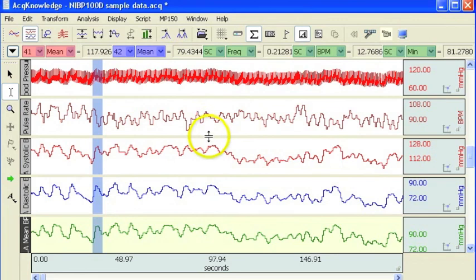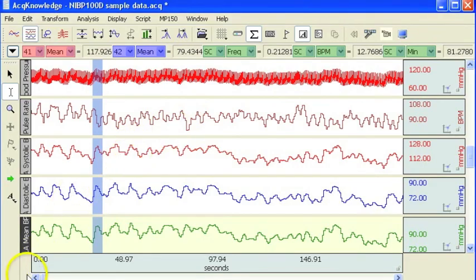So that concludes our demonstration of the AcqKnowledge Epoch analysis routine. Thank you.